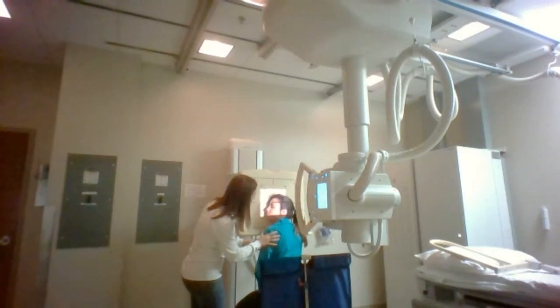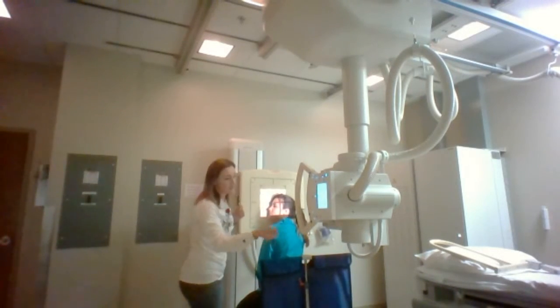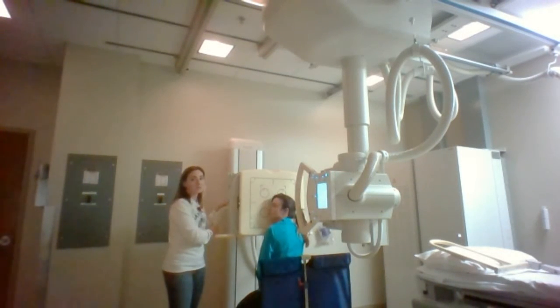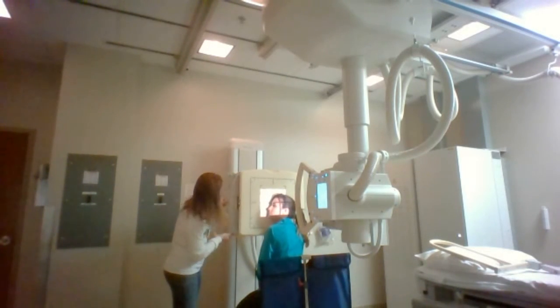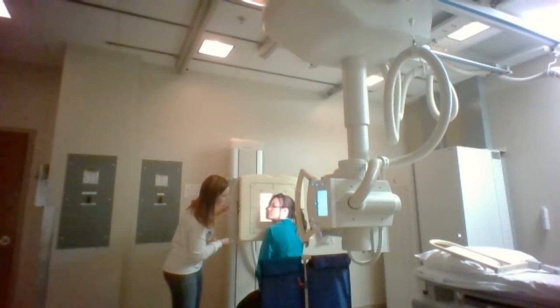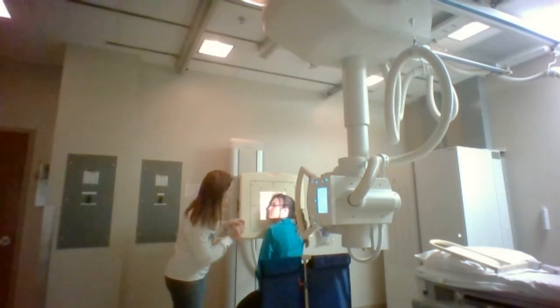I'm going to bring you back just a bit. This is a little bit too high. You want your central ray to be horizontal and entering half an inch to an inch posterior to the outer canthus. This is our outer canthus here. So we are good. We're going to come down to about there. Okay, there we go. So now we're nice and aligned there.